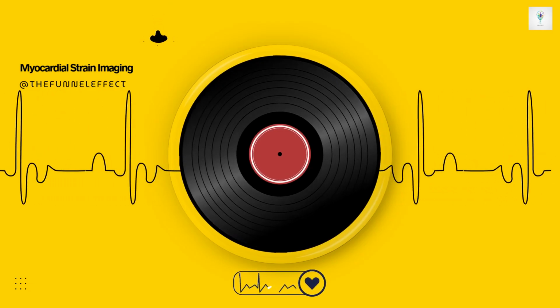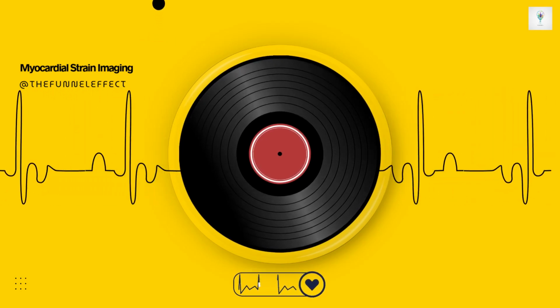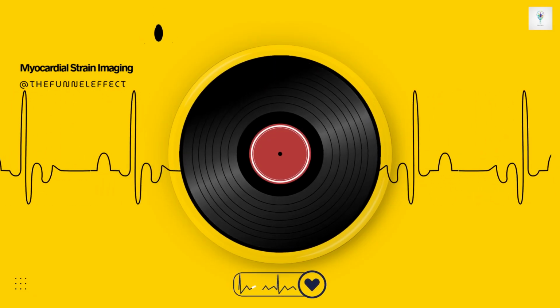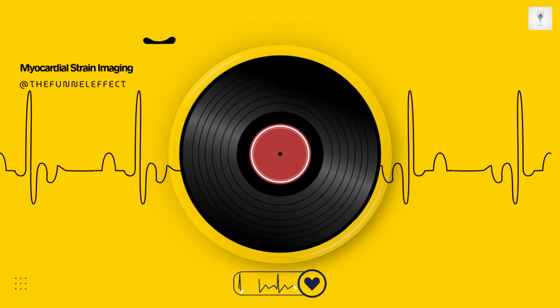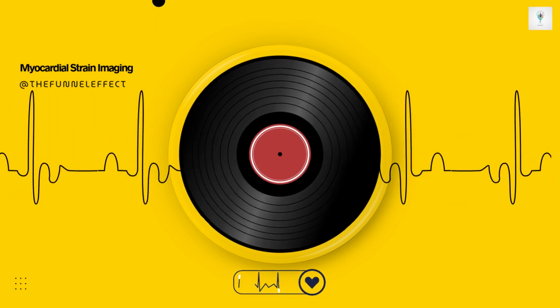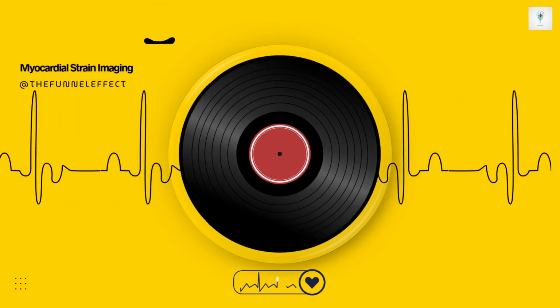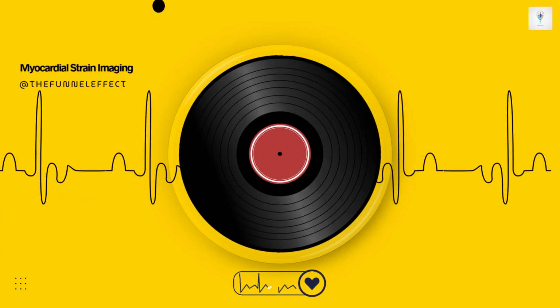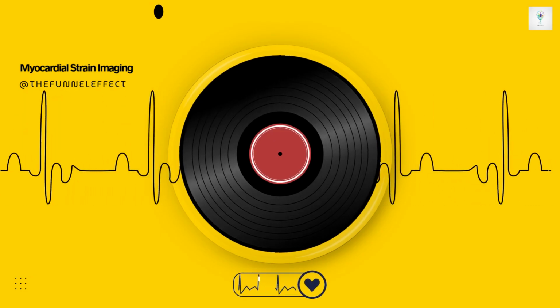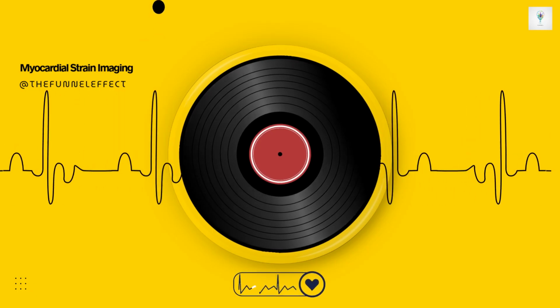Okay. Next big area, dysynchrony in cardiac resynchronization therapy, CRT. Strain seems tailor-made for assessing timing issues. It really is. CRT, using specialized pacemakers to resynchronize the heart's contraction, works best when the problem is primarily an electrical conduction delay, like a left bundle branch block, which causes different parts of the ventricle to contract way out of sync. As opposed to dysynchrony caused mainly by large areas of scar tissue from a previous heart attack, where the muscles simply can't contract regardless of timing. Strain helps distinguish electrical dysynchrony, which CRT can fix, from mechanical disparity due to scar, which CRT might not help.